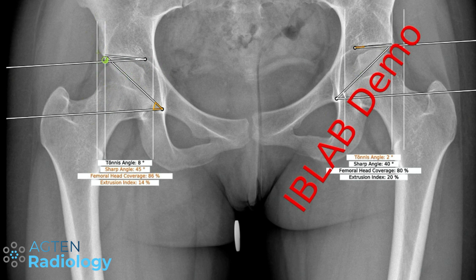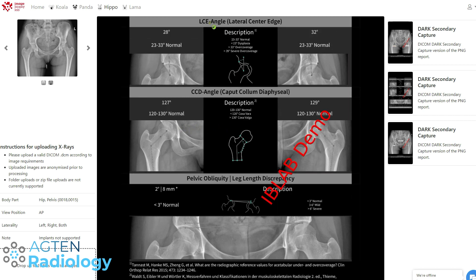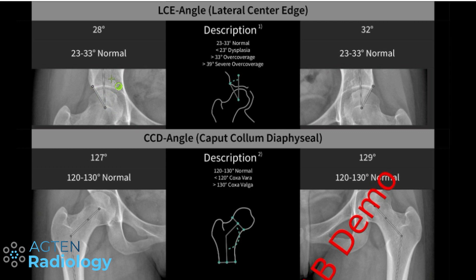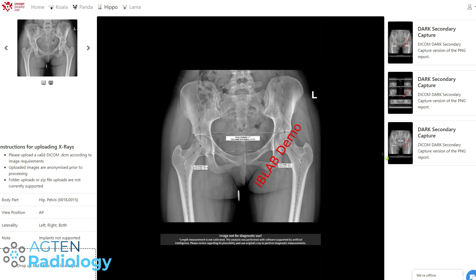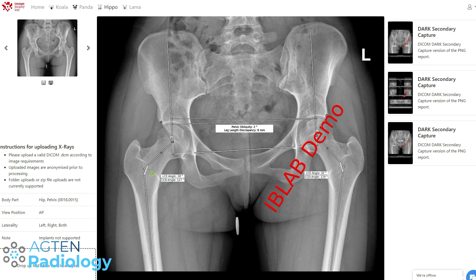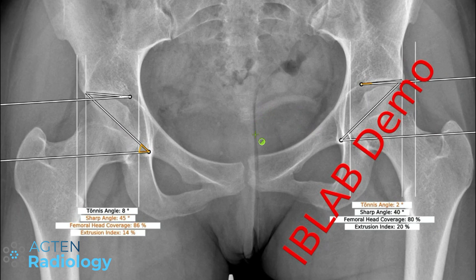These vertical lines and angles are also presented in a report here — the lateral center edge angle shown here. They also provide the reference values for both sides separately. This is basically what would get sent into PACS as a DICOM result. Then we've got the other one here with the CCD angle on both sides, and you can also see how it's recognizing that the pelvis has a slight tilt to the right side.